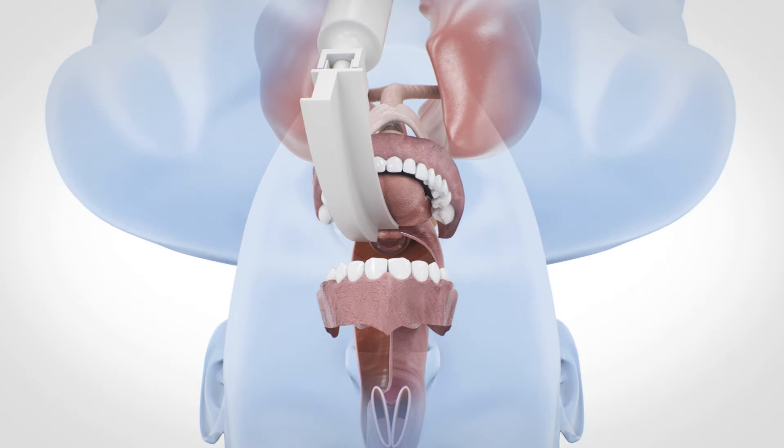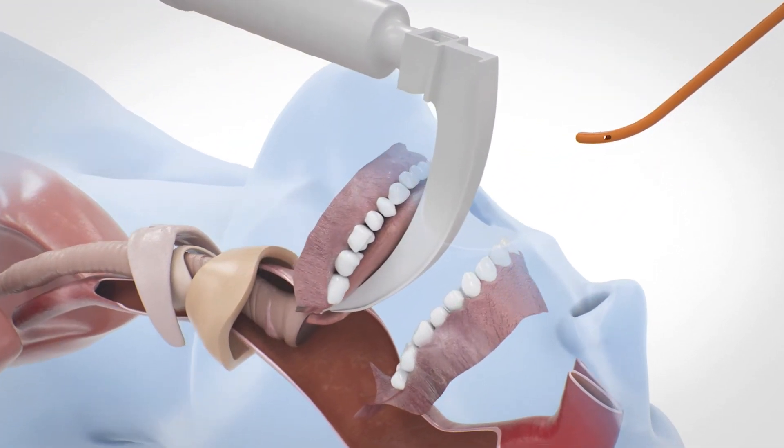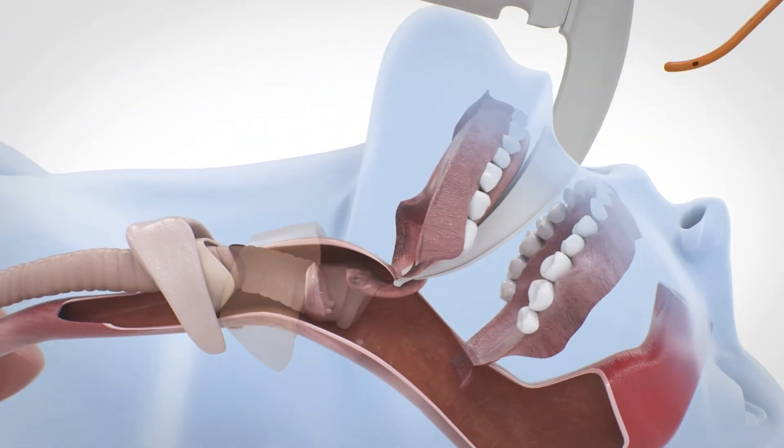If the glottis is visible, advance the EyeBougie through the vocal cords into the trachea between 2 and 3 cm.